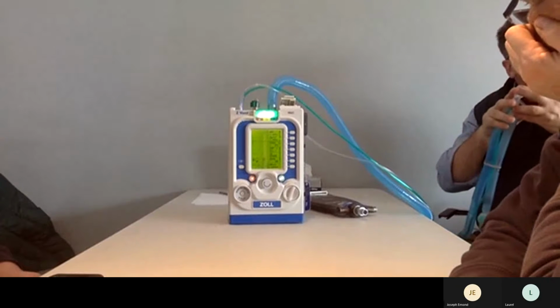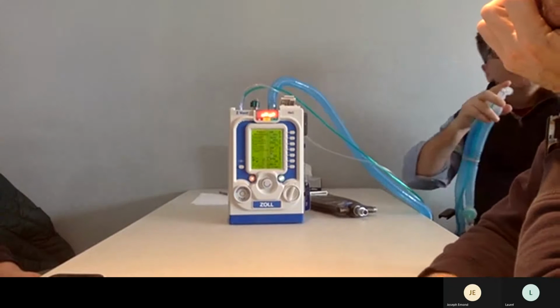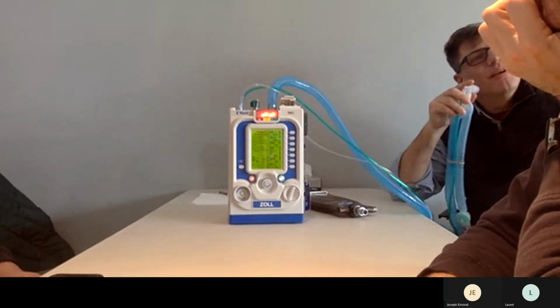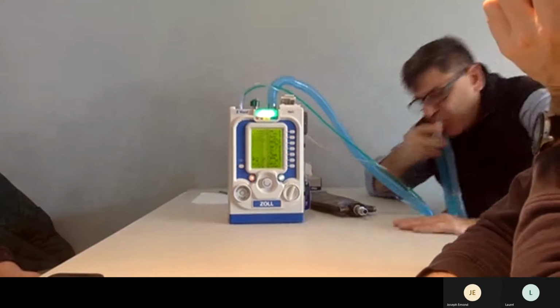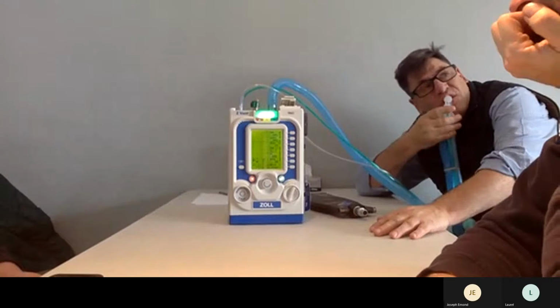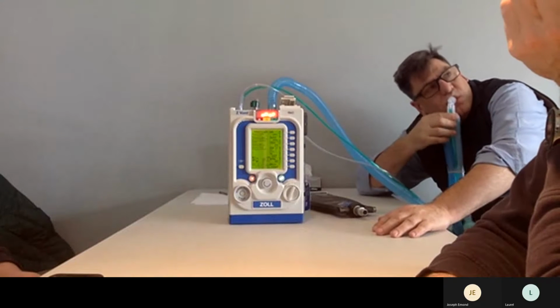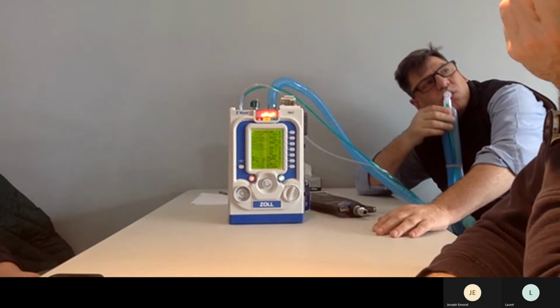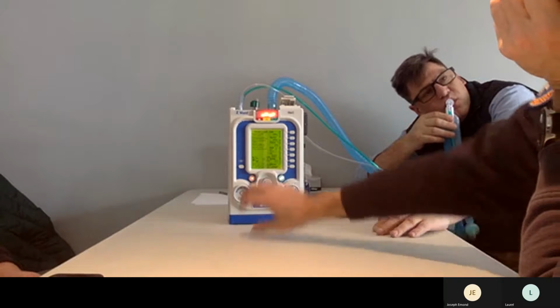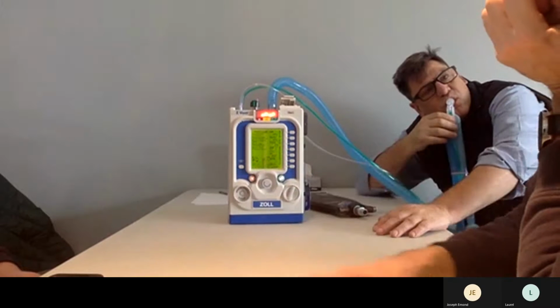So did you see the jaw thrust I did? Because you hear the difference just from a good BLS airway. Right? Can't lift. Don't breathe. You can't breathe. I'm not getting enough. Just in through your nose, out through your mouth. Sir, breathe gently out. In and out. Keep calm. Leak down, in, up, down. Check your mouth seal, and out.